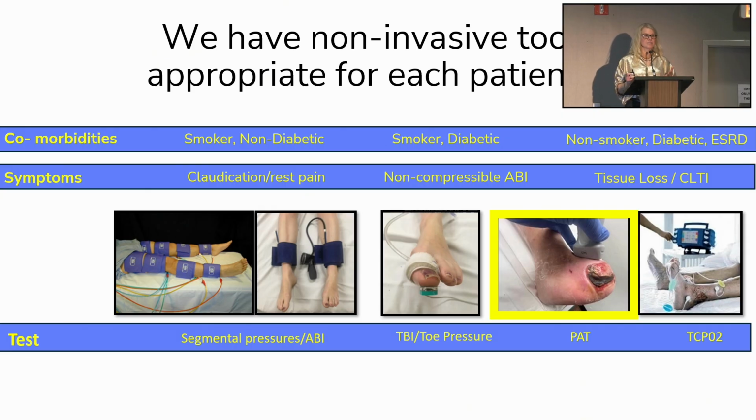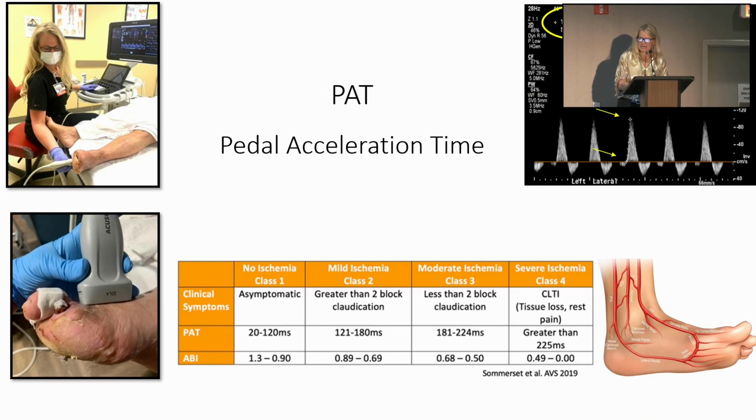This is using standard ultrasound to actually scan the arteries in the foot. And this is very valuable when your patient looks like this and they have no toes, and we have to tell Dr. LeSar what the blood flow is like to the foot. So I actually developed this technique in 2017 by just scanning my own foot, and I realized how well we could see these vessels in the foot by using ultrasound.